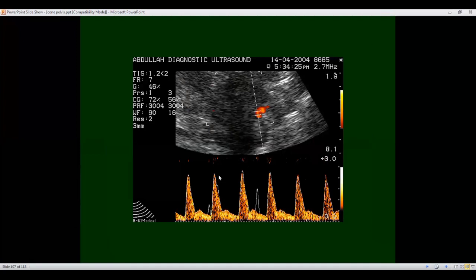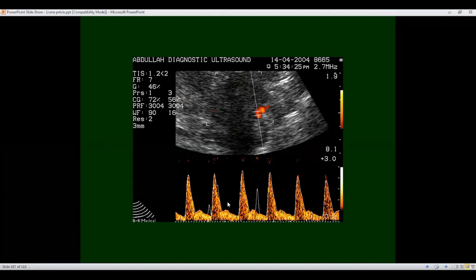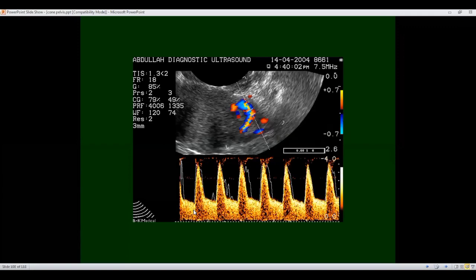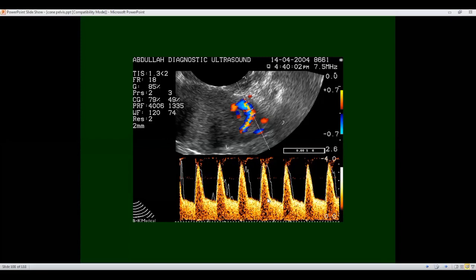But when a uterus becomes pregnant, we will see that due to the increased demand of the uterine contents - the fetus developing, the placenta and all that - the flow through the diastolic phase will increase and this notch will get filled. Here you can see the notch, and here you don't see it - so it is filled. This is how we find increased flow through the uterine artery in a growing fetus.